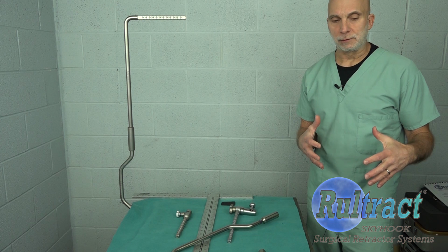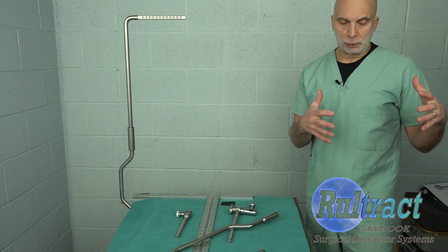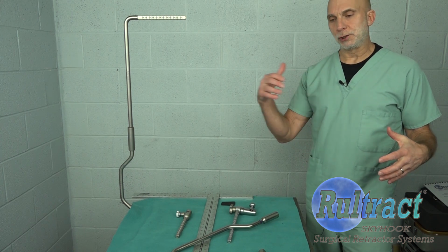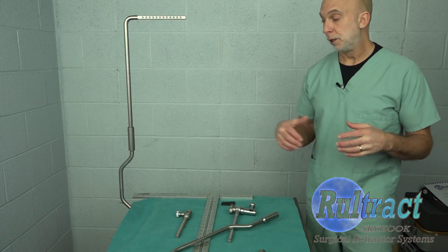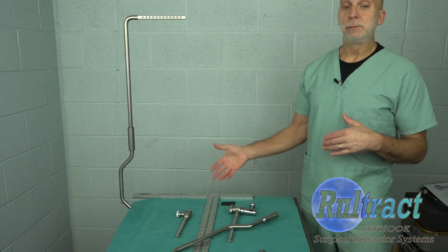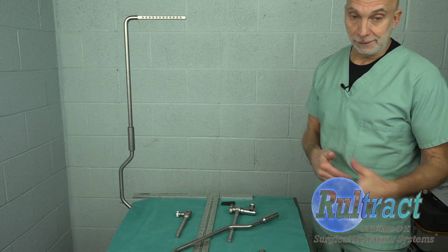When you set the retractor up for IMA, the Rultract is on the left and the surgeon is on the patient's right. When you set the retractor up for the minimally invasive procedure, you're going to set it up on the right because the surgeon is going to be on the patient's left.